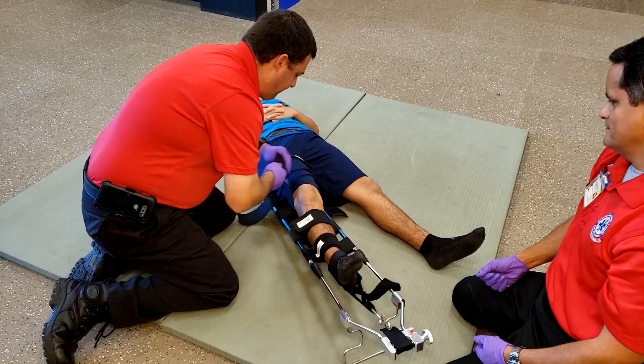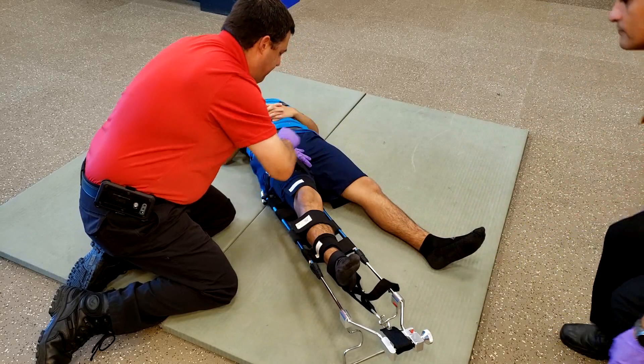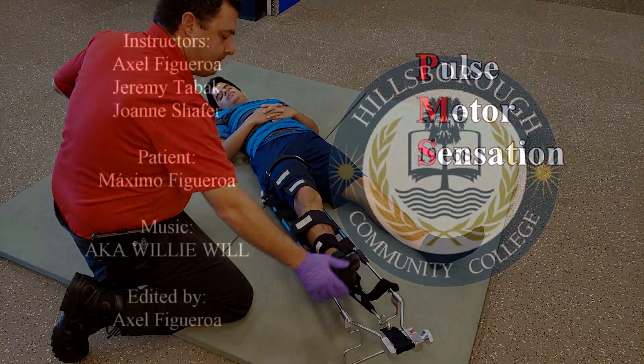It is worth noting that if one of the straps on the thigh area falls on top of the fracture, you may be able to leave that strap undone. Last, check pulse, motor, and sensation once again after the splint is done.